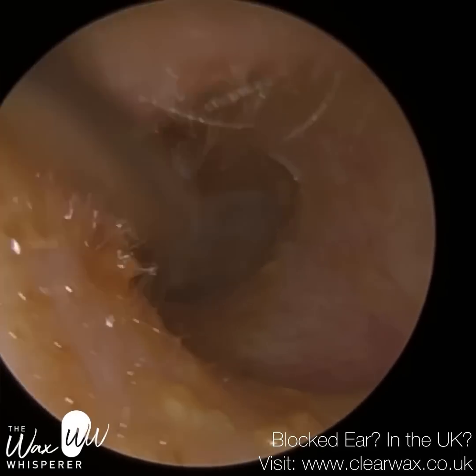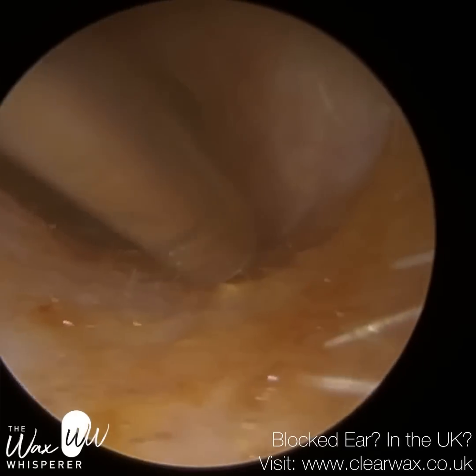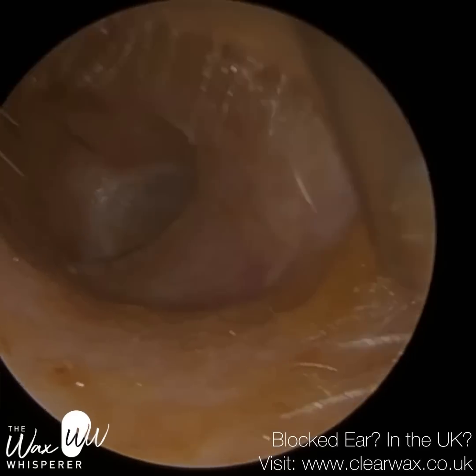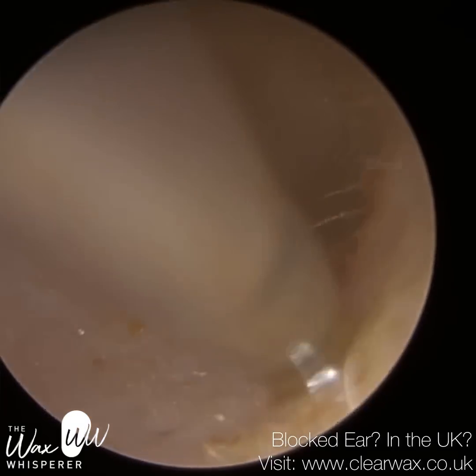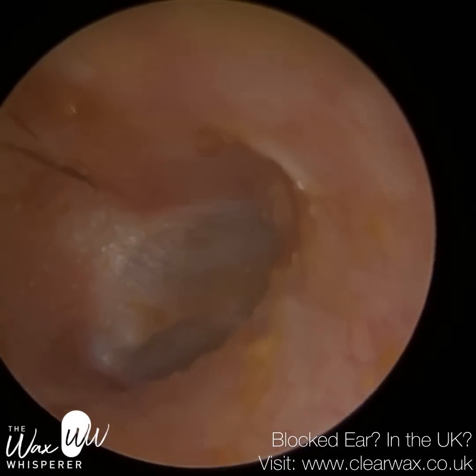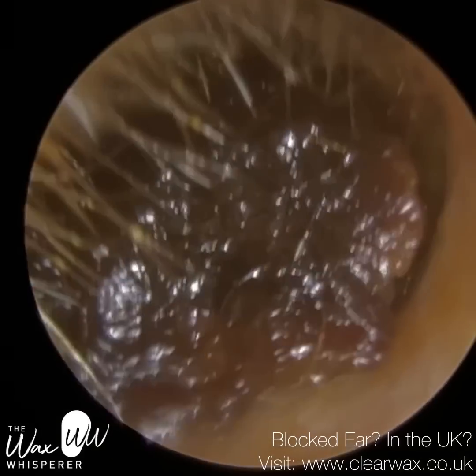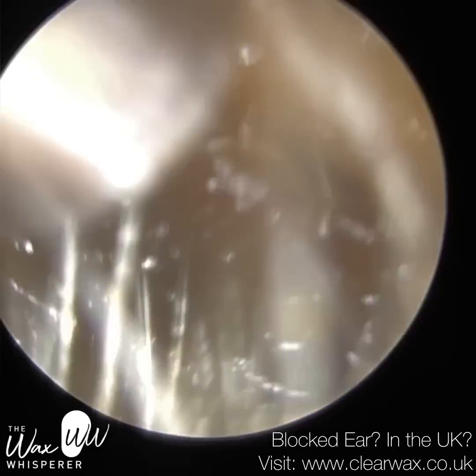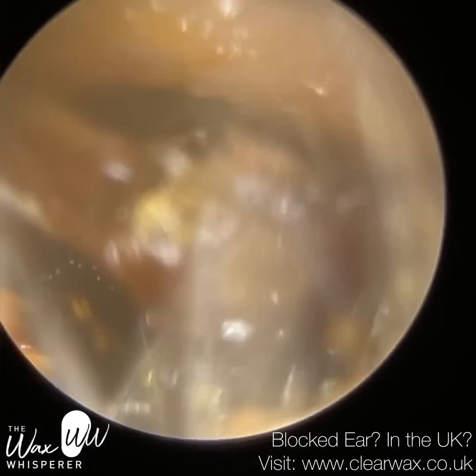Also, their inferior recess. When you go near the eardrum, the ear canal narrows and then widens again, and it creates a basin at the bottom called the inferior recess. In this view, you may be able to see that divot a bit better. Sorry to just move away from the eardrum. You can see there at the bottom, there's a good view there. It's almost like a mountain peak. It kind of goes down and then up and then down again, like a mountain slope. And that inferior recess is quite a pronounced one, and sometimes you can't fully visualise the eardrum as a result, and sometimes earwax can drop into that inferior recess. It can be difficult to remove.